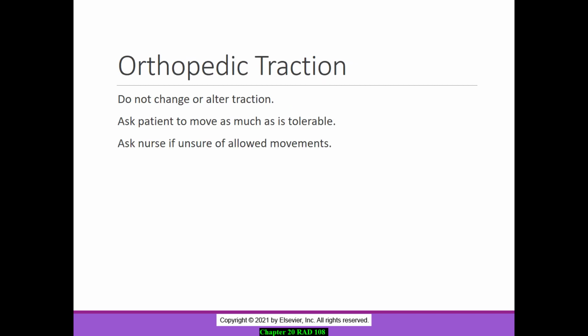If you do run across an orthopedic traction, don't change the traction. Ask if your patient's able to move. So it may be, their femur's in traction, but they're able to at least raise the lower portion of their body to allow you to slide the image receptor underneath.